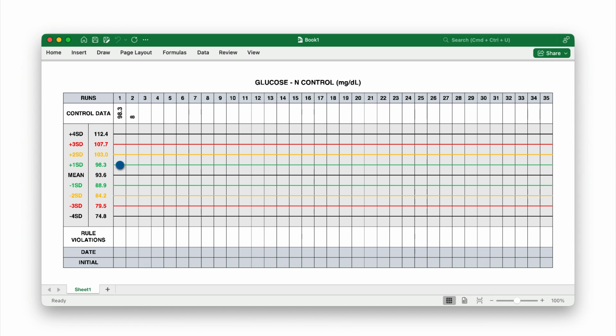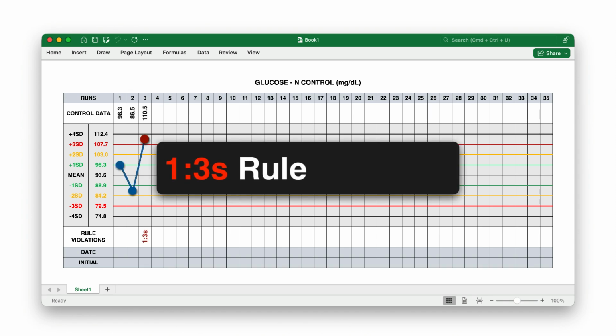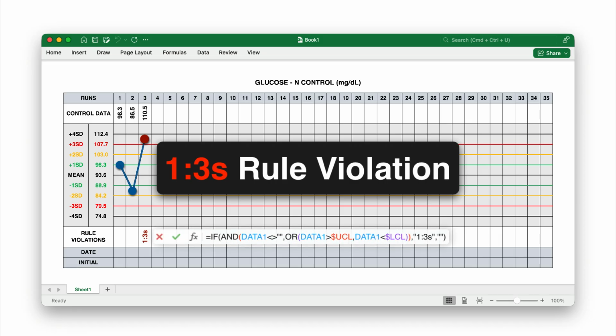Hello everyone, welcome back. In today's video, we're going to learn how to detect the 13S rule violation in Excel using a simple formula. We'll apply it to the control chart that I built in the previous video.